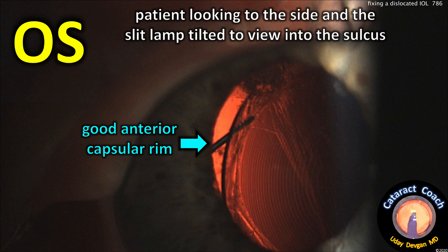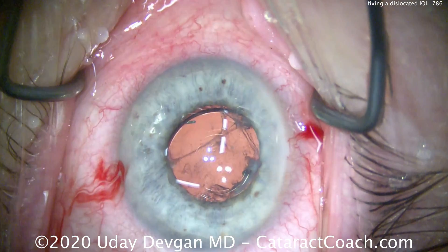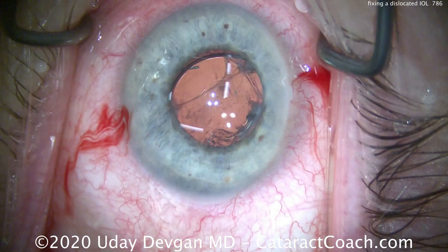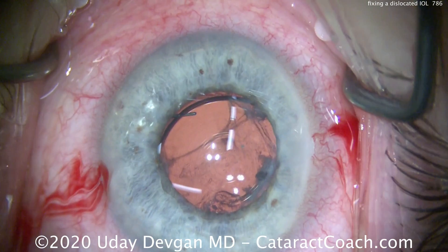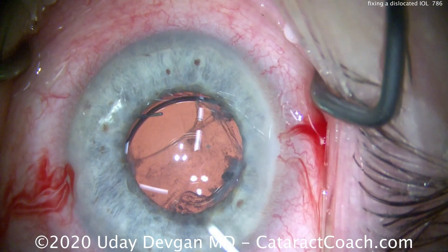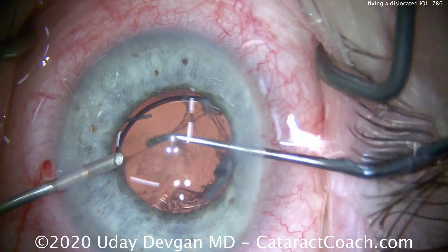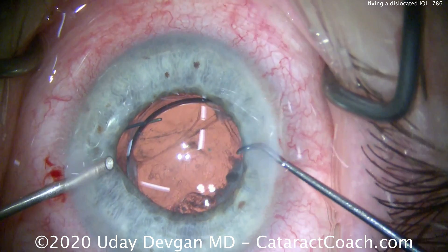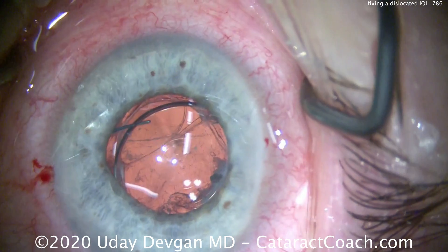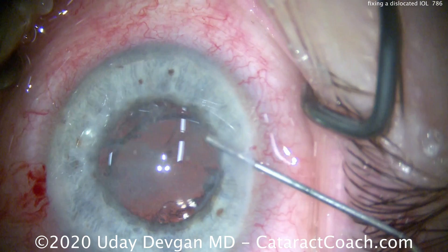We can see there is good anterior capsule rim, especially when we put the slit beam to the side. Here's the patient on the OR table — we can see the dislocated lens. There's some residual cortex or fibrotic tissue in the periphery, and we can see the lens capsule has a hole in it in the nasal quadrant. Using an infusion in one hand and the chopper in the other, we're looking around to assess how much vitreous is prolapsed.